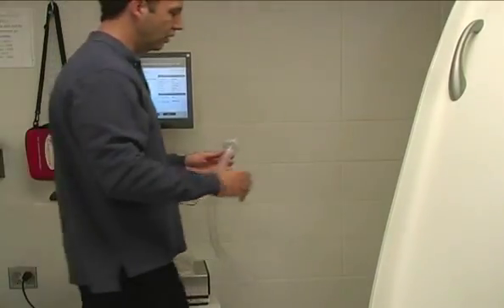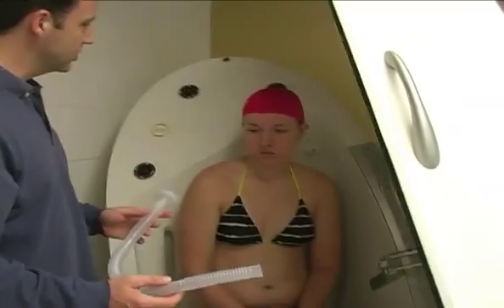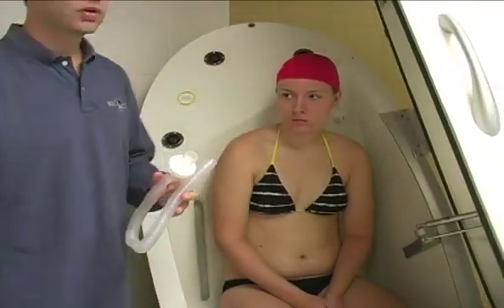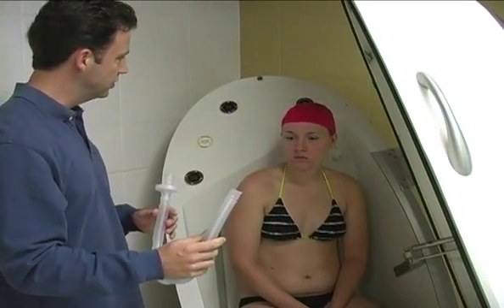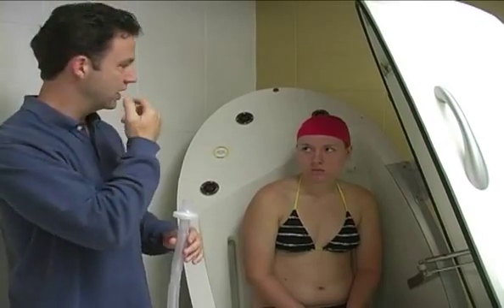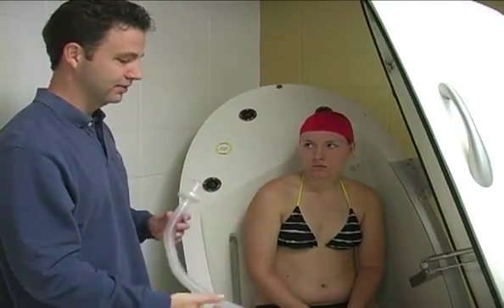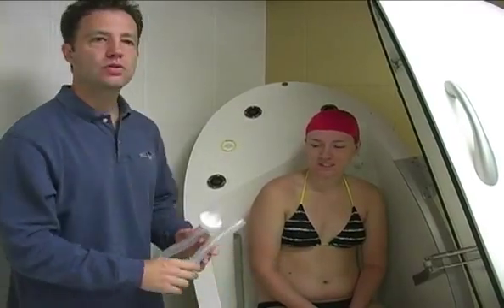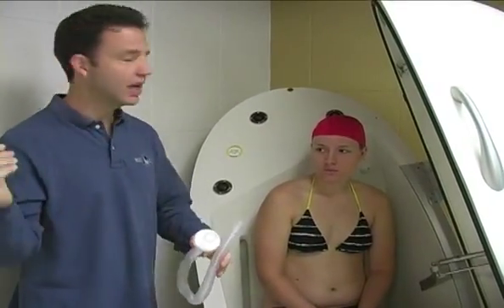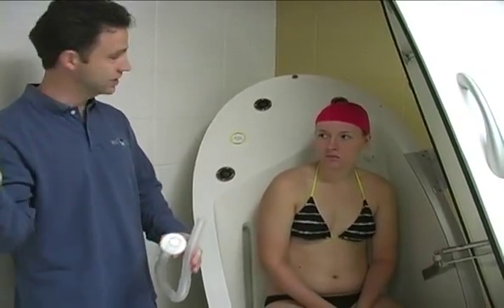So what we're going to do now, Brittany, is we've measured your body volume. What is essentially going to happen is I'm going to move the computer screen over, and it's going to instruct you when to put the tube in your mouth, okay? And you're going to put the tube in your mouth, create a nice seal, and plug your nose. And breathe as normally as you can with a tube in your mouth. So you do that for 10-15 seconds. Again, this will prompt you. It'll say breathe, and there'll be a cadence, in, out. And try to follow the cadence that this shows you.